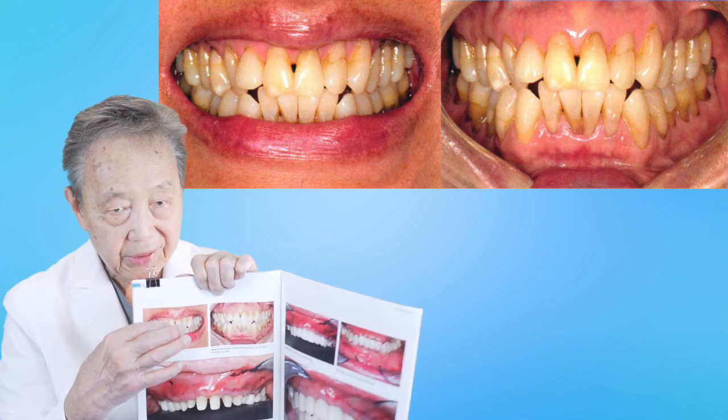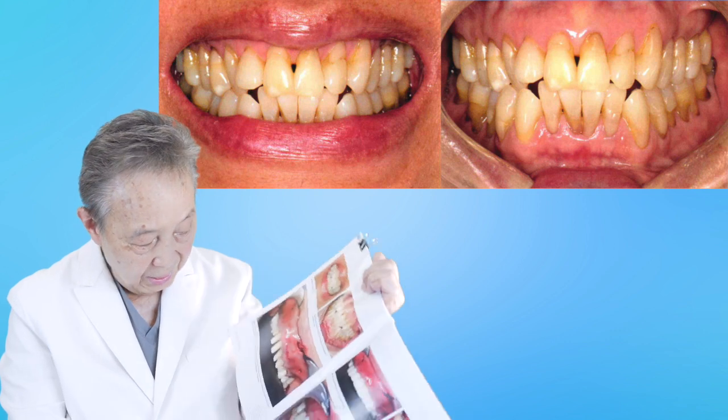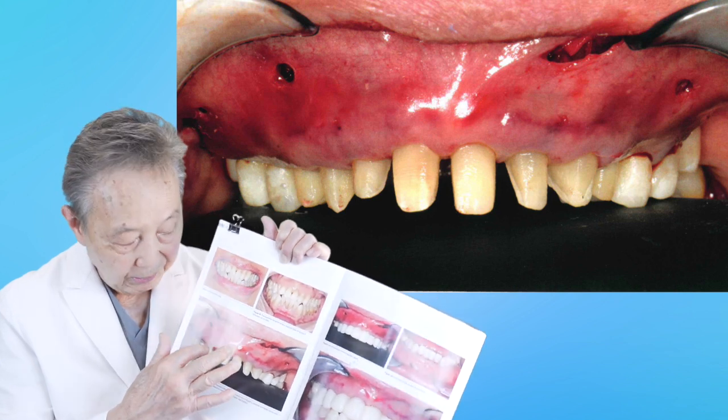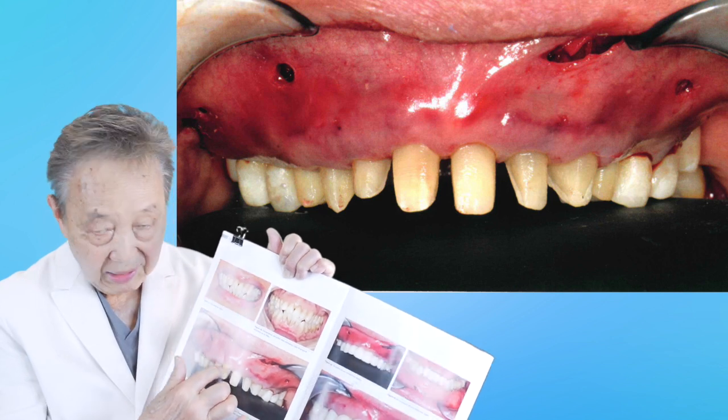So she came in like this, with the recession here — this is smile, this is retracted. And right away, what we did was we prepped her teeth. The teeth were slimmed down, prepped, and then immediately the same day we brought the gums down to this level.